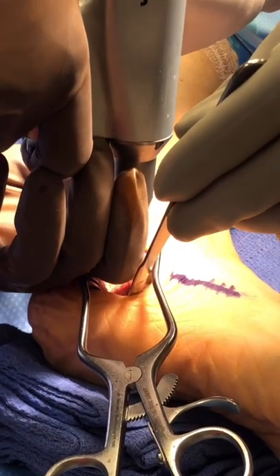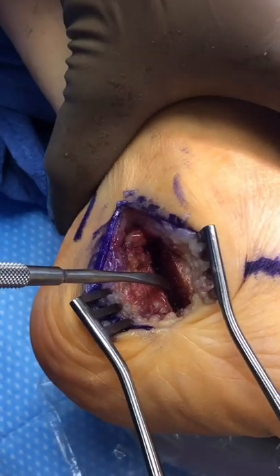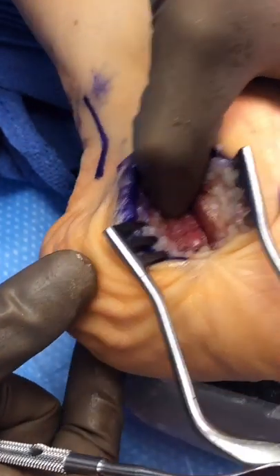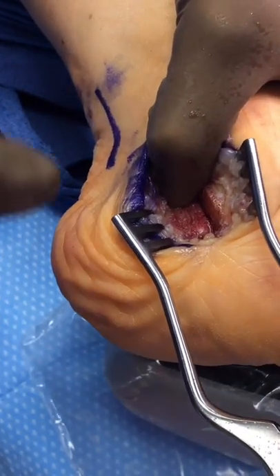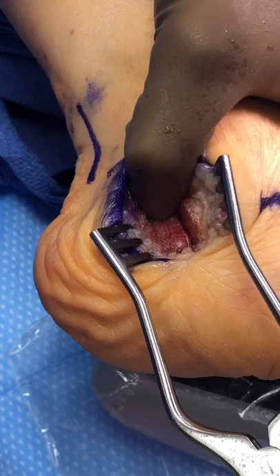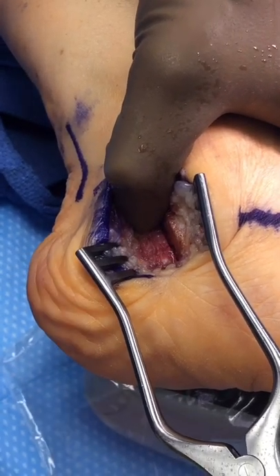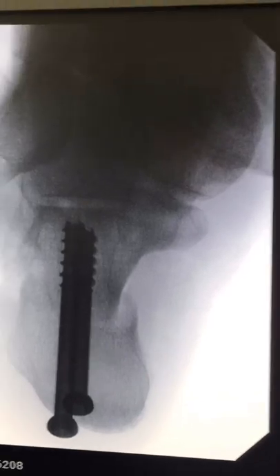Now we've cut the heel bone — you can see that — and we will shift the heel bone over to move it to the inside. Then we'll make a small incision here and put two screws to hold that in place.